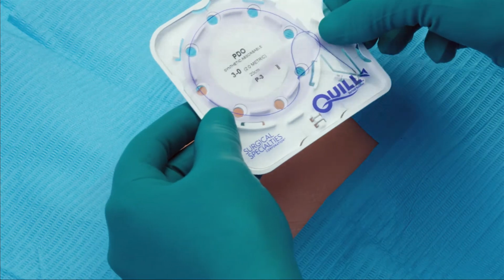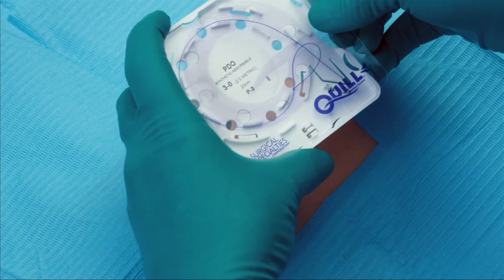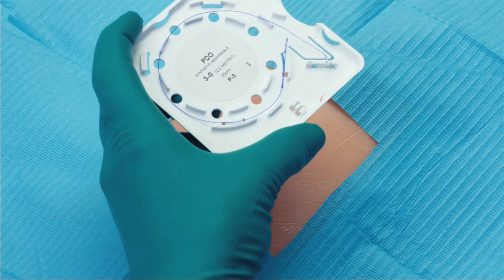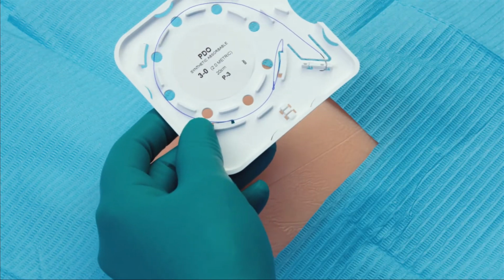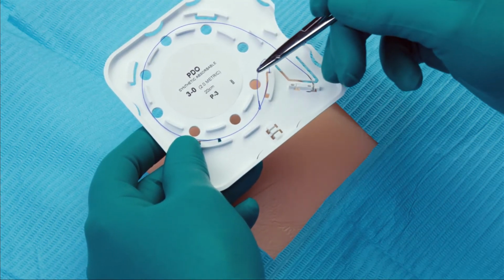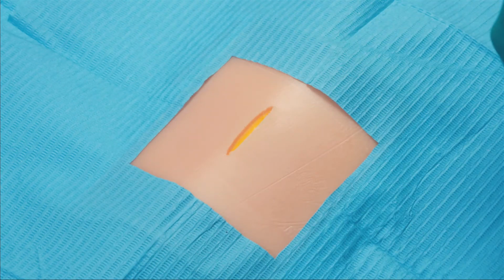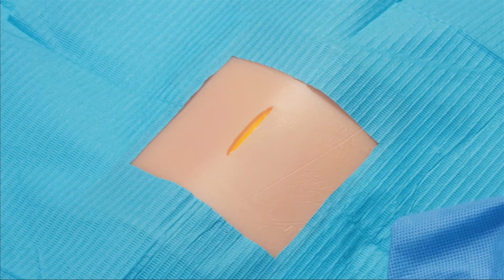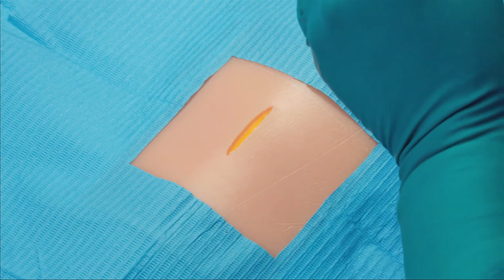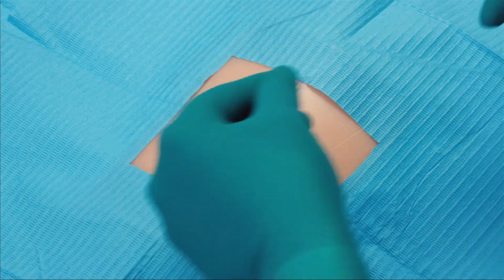I will be demonstrating how to use Quill suture. We will now demonstrate a 2-layer closure using a single strand of the Quill unidirectional barbed suture. We have the needle here and a little loop. And here we are looking at a surgical defect after excision. We will be approximating the deep dermal layer with a Quill device.